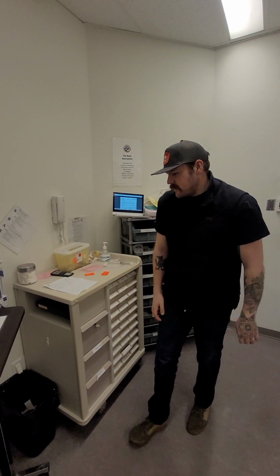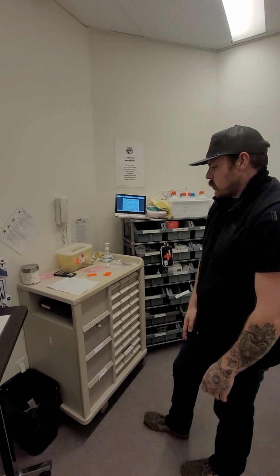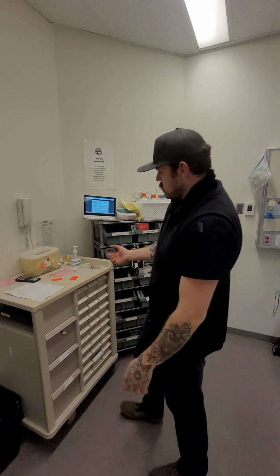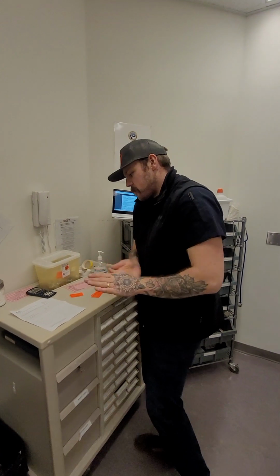Hello, so we're going to be giving cefazolin today. It's an antibiotic. We're going to be doing it through an intermittent IV device. So first things first, let's go ahead, wash our hands, and check out our mark.